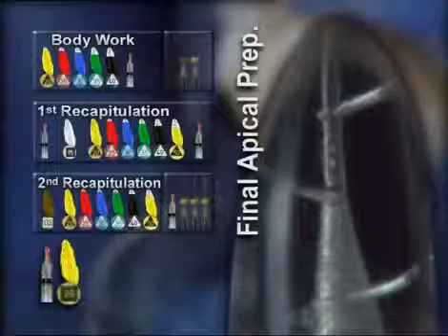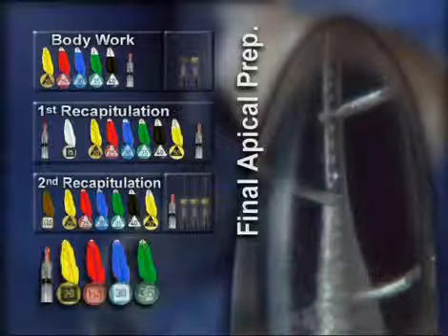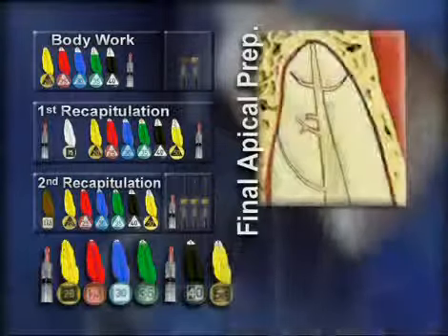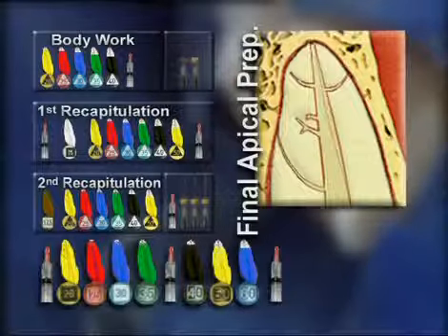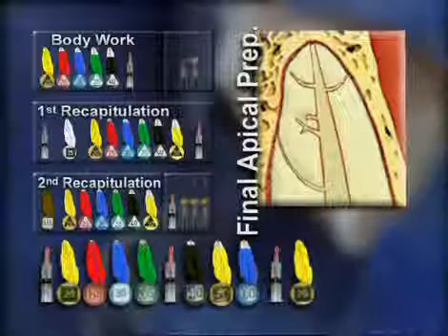Apical portions of canals are best manipulated with files. They are used with short in and out strokes in the long axis of the pre-curved instrument. Files are worked in a gentle motion, only to a depth where they are slipping and sliding passively. The multiple waves of delicate shaping finally lead to an extremely smooth tapering preparation.